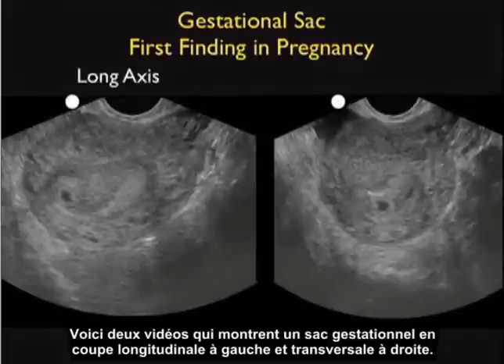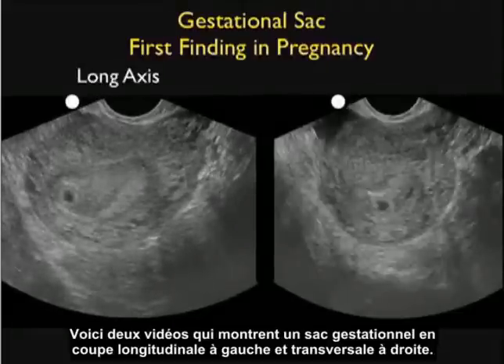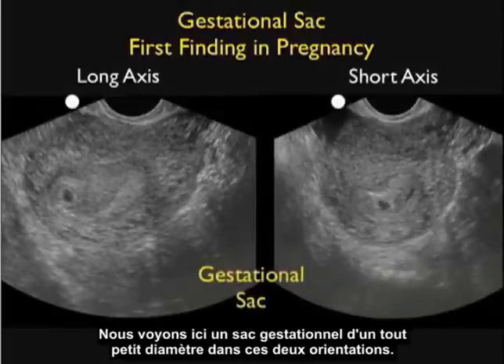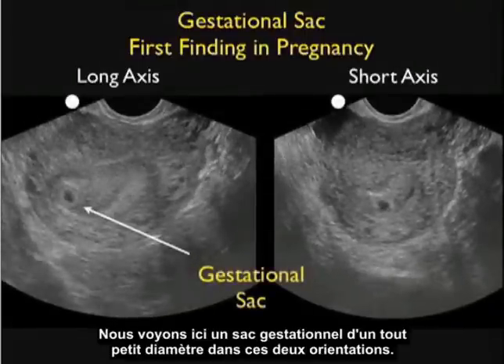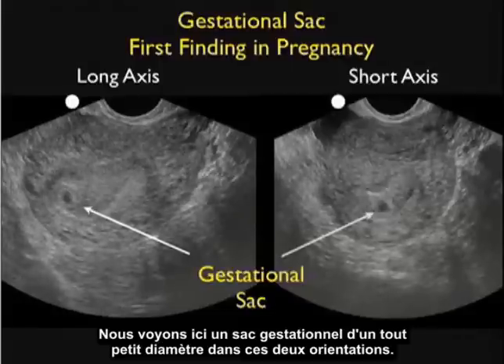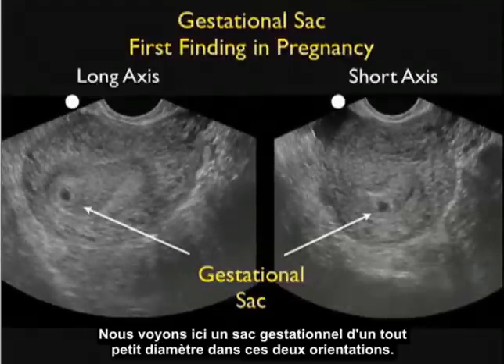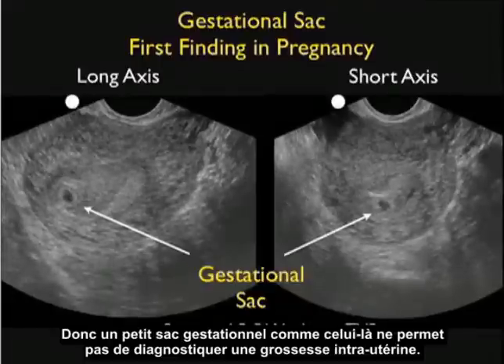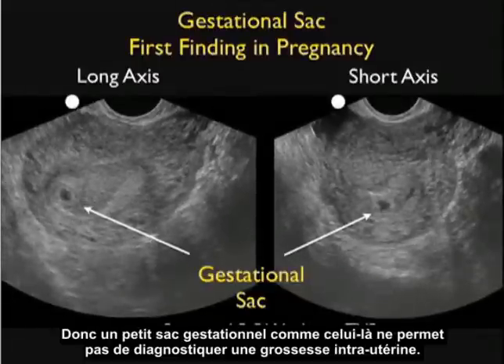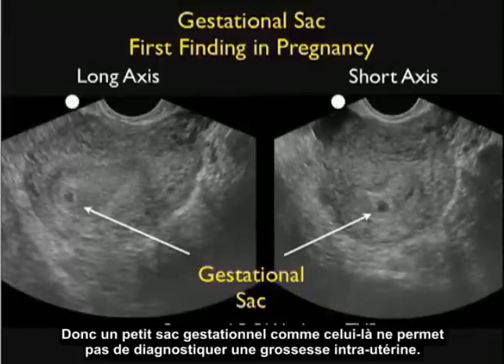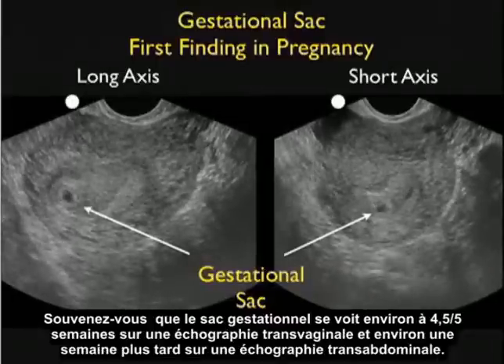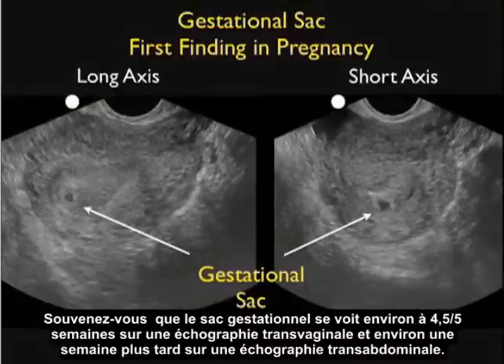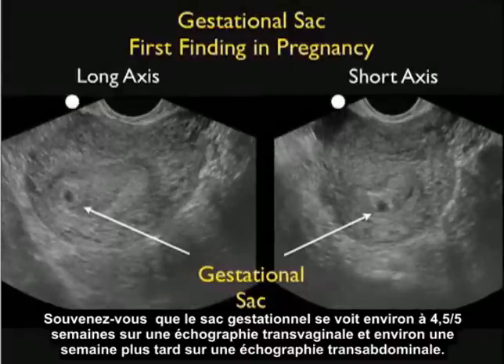Here are two video clips showing the gestational sac — long axis to the left and short axis to the right. We see a very small diameter gestational sac in both orientations. Unfortunately, this can be seen with a pseudo-gestational sac of ectopic pregnancy, so a small gestational sac like this is in no way diagnostic of an intrauterine pregnancy. Remember that the gestational sac is seen at about 4.5 to 5 weeks on transvaginal sonography and about a week later on transabdominal sonography.